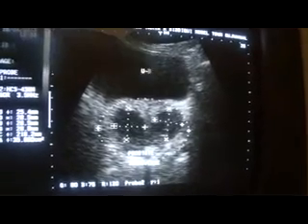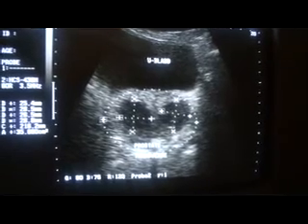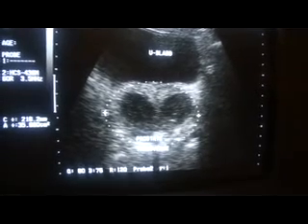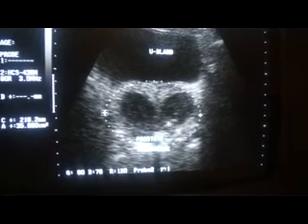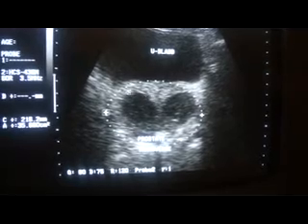Let's see the urethra. This is the urethra, the prostatic urethra, and the important thing to note is that the periprostatic fat line is intact. This is the prostate, this is the prostatic urethra, or no, this is a shadowing from the echogenic area. You're seeing it anteriorly.